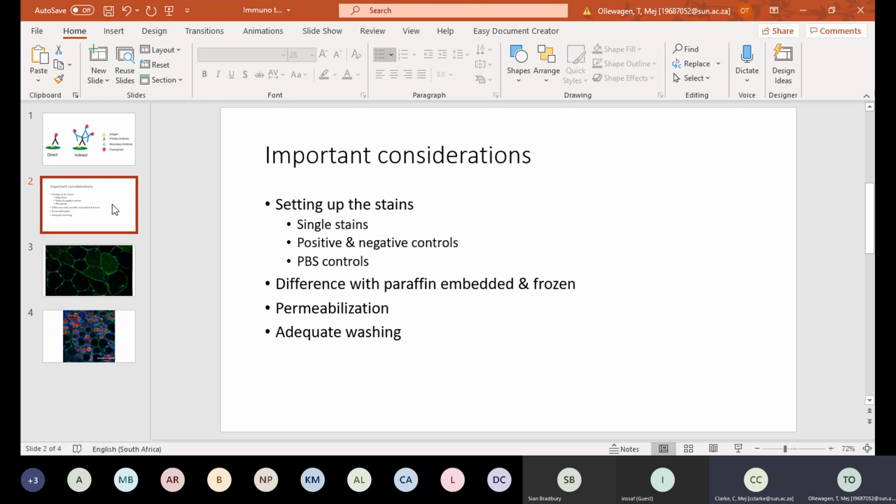So in that sense, if you are using multiple stains and multiple antibodies, I would suggest using single stains initially and making sure that all of them work with the secondary that you are using, and that there isn't any autofluorescence that the secondary is staining before adding them together. So you'll first do your single stains with your multiple different antibodies, and then you'll test them out together and make sure that you are seeing the thing that you are supposed to be seeing.